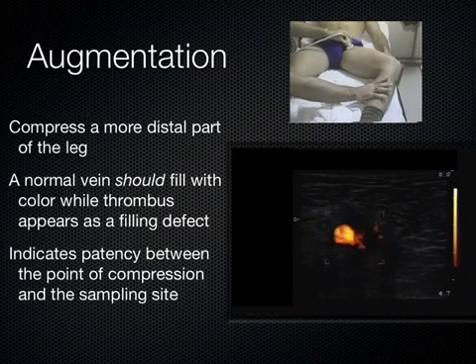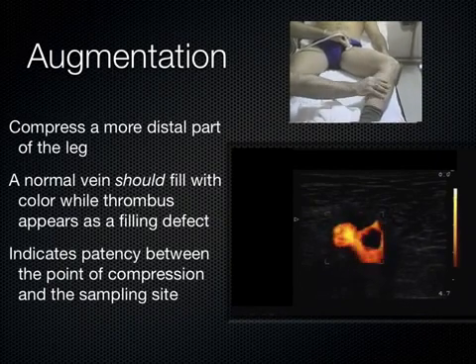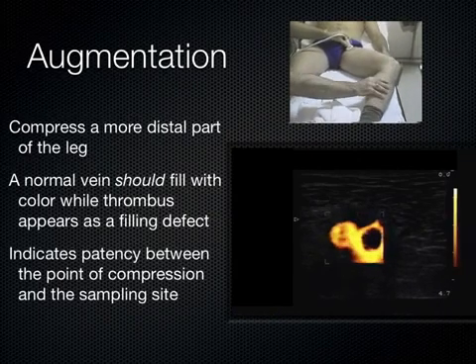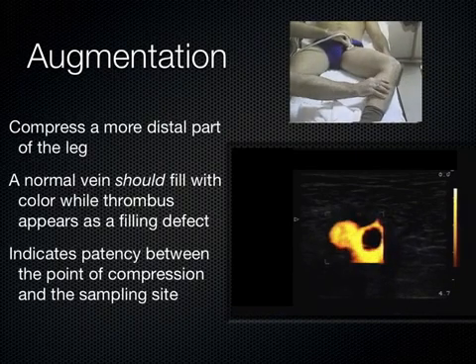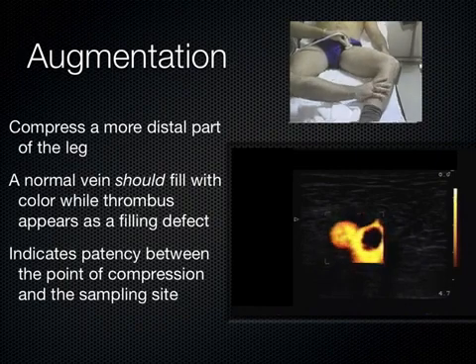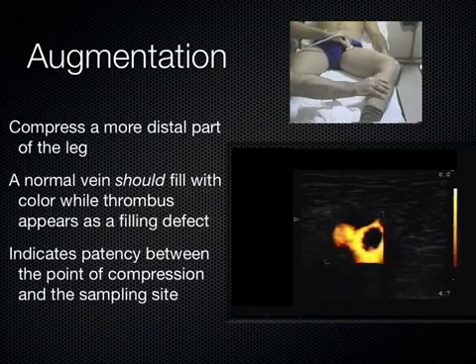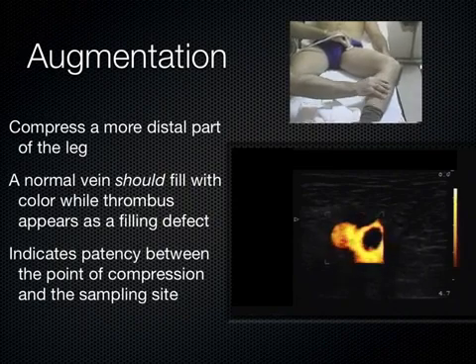One final word before I conclude is that you may not be aware that after hours and on weekends around the country, in about 85 to 90% of hospitals, it's actually not possible to get your patient a DVT study, because there's no staffing, there's no ability to do it. And so what do you do in that situation? You have a patient that you think could have a blood clot in their leg, you can't get the study done, and so what you end up doing, at 7 p.m. or on the weekends, is basically waiting, giving the patient a blood thinning agent like Lovenox or heparin, and waiting until the next day when the ultrasound tech comes in to scan the patient.